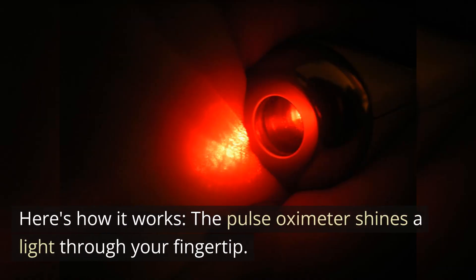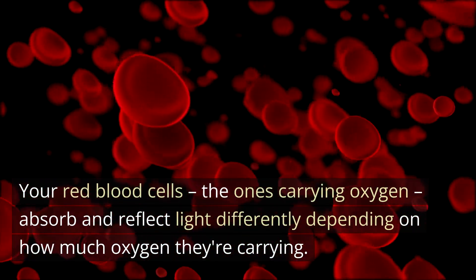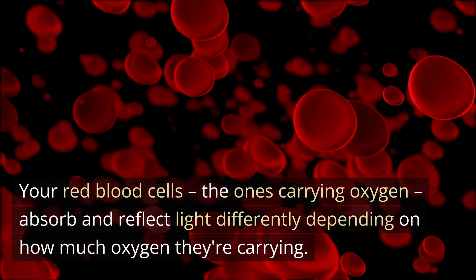Here's how it works. The pulse oximeter shines a light through your fingertip. Your red blood cells, the ones carrying oxygen, absorb and reflect light differently depending on how much oxygen they're carrying.